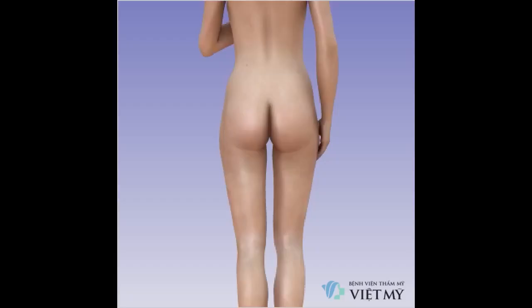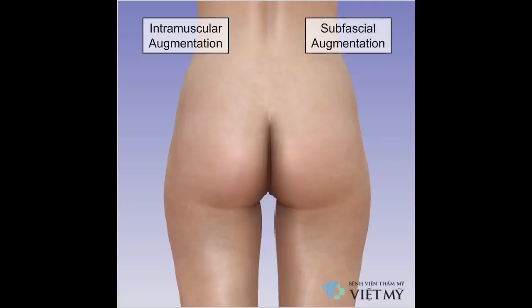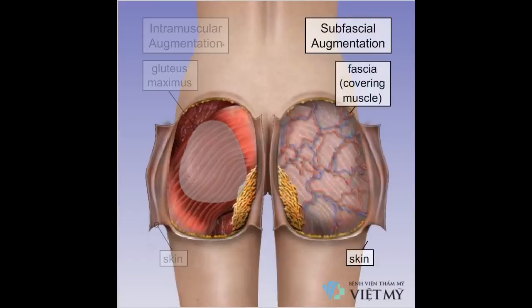This animation demonstrates the gluteal implant procedure using an AART Style 2, Size 3 implant. Several surgical techniques may be used for gluteal implants depending on the desired position and appearance. The two techniques that generally produce the best results are the intramuscular and subfascial buttock augmentation procedures. Intramuscular augmentation involves creating a pocket within the large gluteus maximus muscle. In contrast, the subfascial augmentation procedure creates a pocket under the fascia, which is a membrane of tissue that covers the top of the muscle. Using these techniques, the implant is protected by tissue under the skin or tissue and muscle fiber, producing a comfortable, natural-looking, and visually pleasing result.